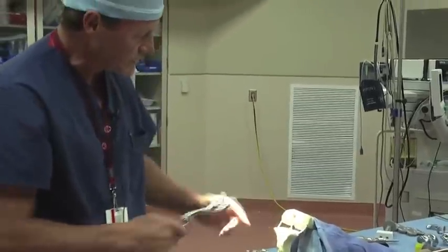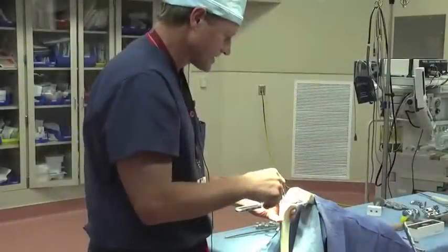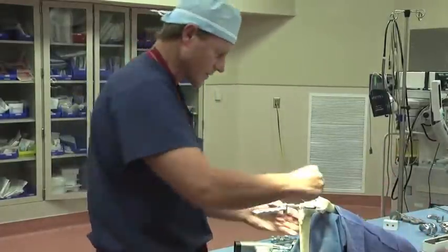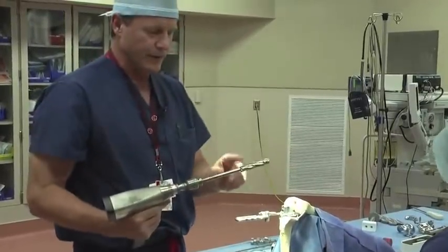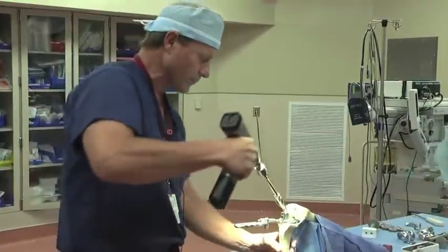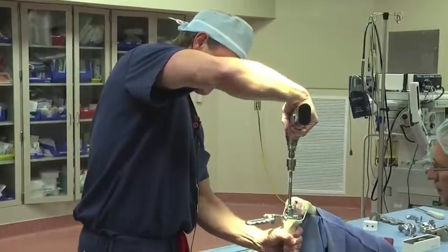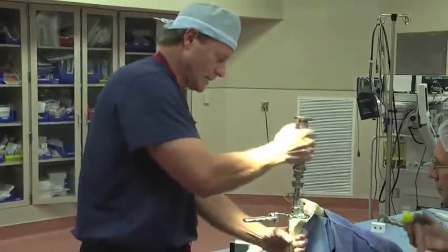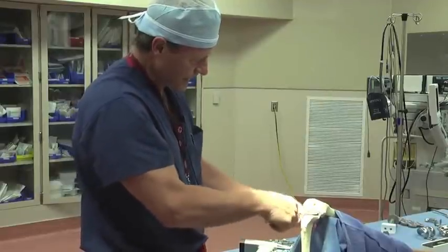Next, similar to the femur, we want to measure the size of the tibia. We have multiple sizes to mix and match so we get the perfect fit on the patient. The next step will be to pin this in place. We have a little tower that goes onto this, and we'll put this in place. We'll go down to the depth of the indication on this reamer here to make our hole for our stem that goes on this particular component. Then there's a punch with fins that matches up to what we'll put in for our final implant. Once we've prepared the tibia, we'll go ahead and remove this handle.